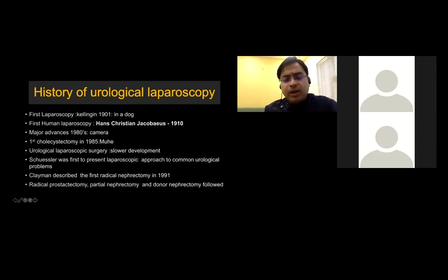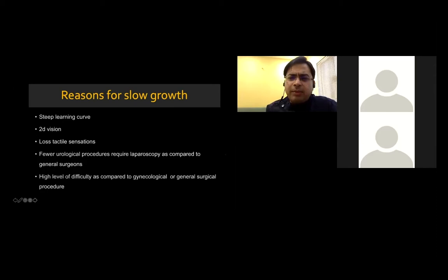I always wonder, and I ask my generation, are we willing to put in that kind of effort to learn laparoscopy? While laparoscopy is growing slowly, it has a steep learning curve because what you see is a 2-dimensional view of a 3-dimensional structure. You don't get any haptics. And there is always an argument that it is a difficult thing to achieve.